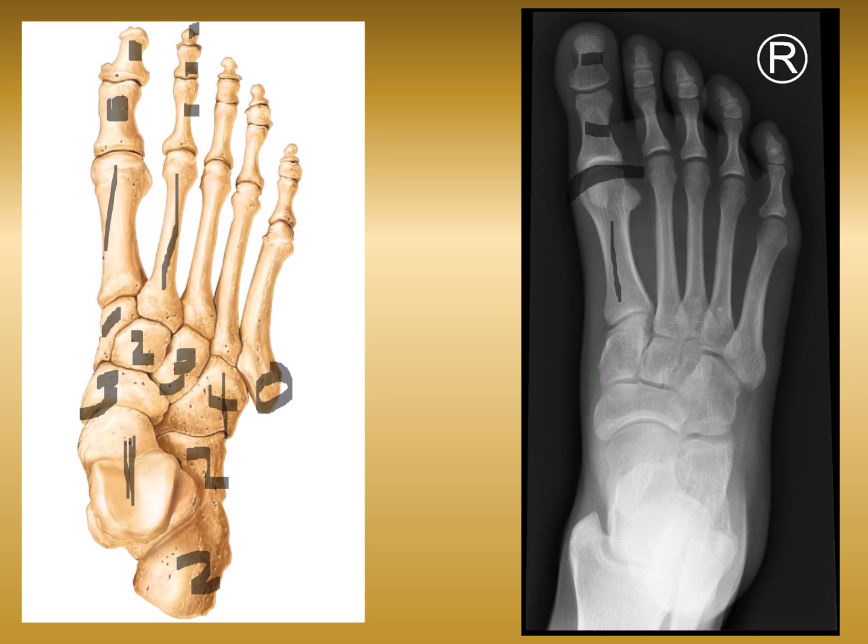Right, then we can follow that first metatarsal to the first cuneiform. Then we've got the second and the third cuneiforms, which are kind of superimposed here, the third and the cuboid superimposed, because now this part here is all cuboid, and it's a little superimposed with that third cuneiform. This part here that's articulating with the talus is the navicular bone, right? This one here is the navicular bone. And then this is part of the calcaneus coming up toward that cuboid.